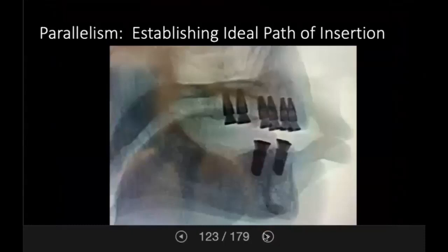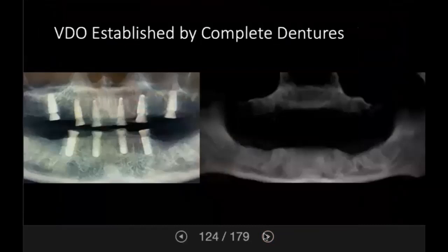All implants are parallel for a single uniform path of insertion for the future maxillary and mandibular removable prosthesis. The removable dentures established an ideal VDO for this case prior to implant placement.